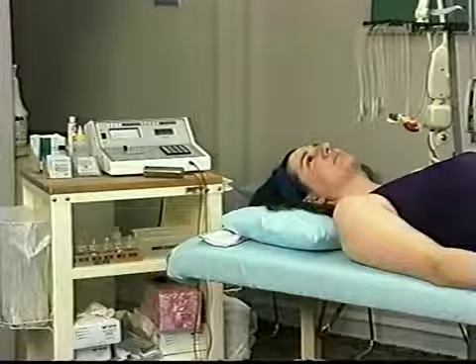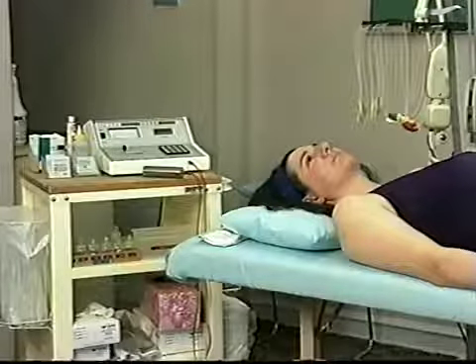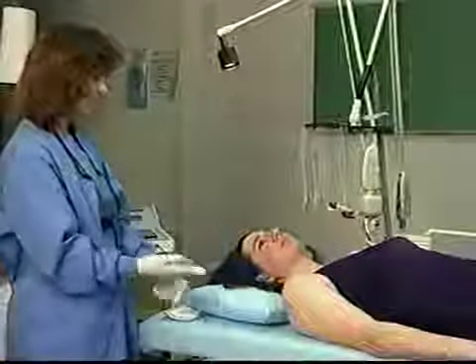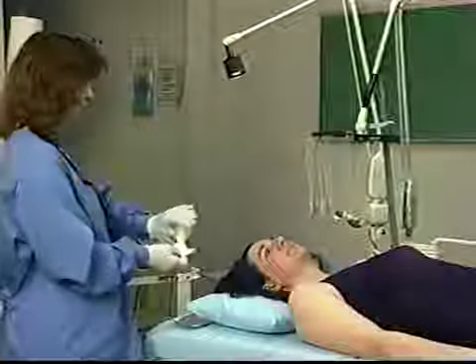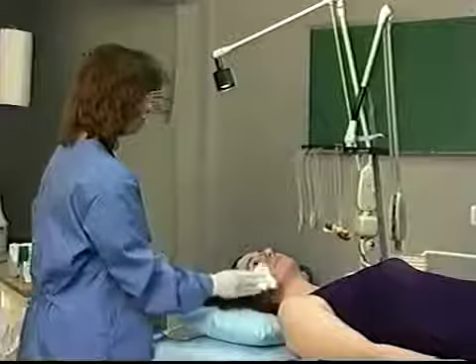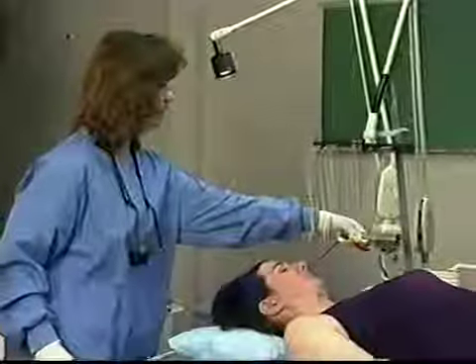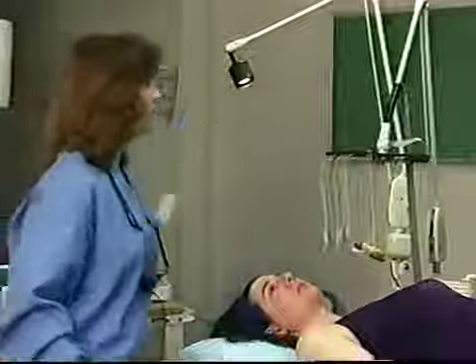In order to offer a good, effective treatment, both the patient and the practitioner need to be comfortable and relaxed. Proper positioning is vital because it can affect the quality and efficiency of treatment. If the patient is poorly positioned, it may be difficult to see the hair, or the practitioner may become quickly fatigued. If you find the needles are sliding out of the skin, it is probably due to poor positioning. Either the patient is not in an ideal position, or the needle cord rack is misaligned.